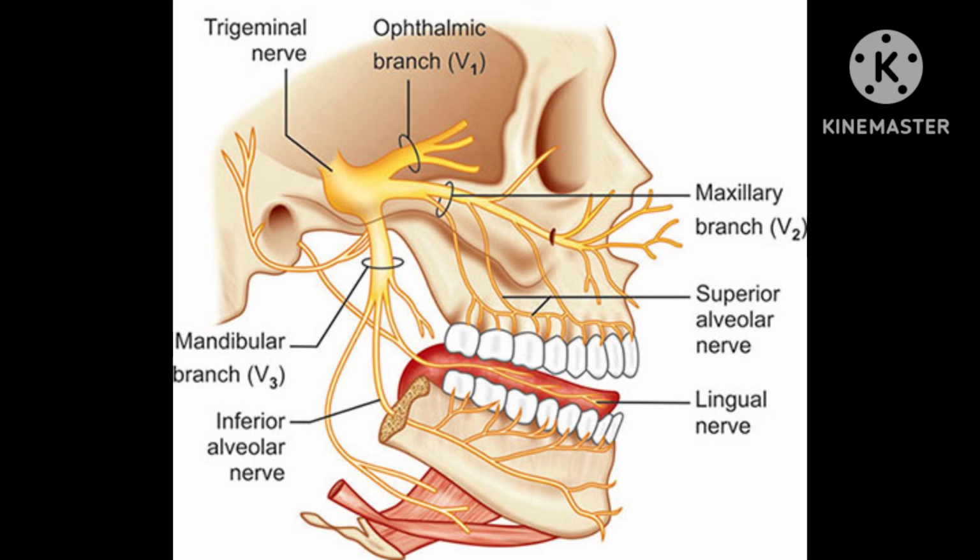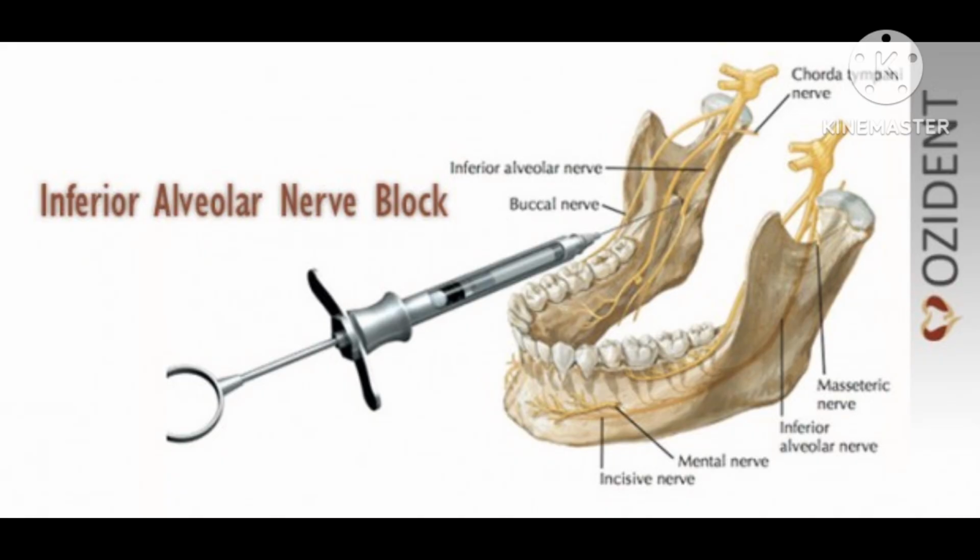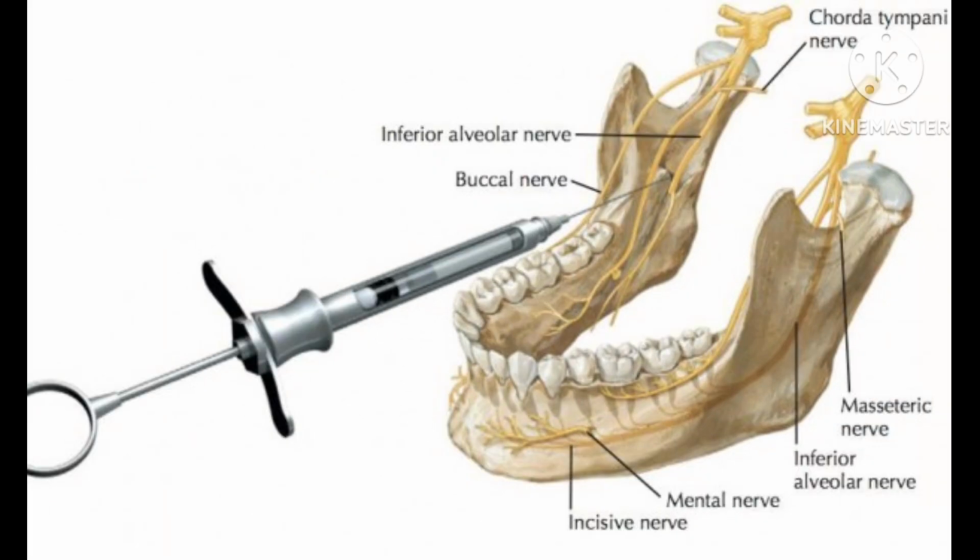Anesthesia of molars and premolars, block. Nervus alveolaris inferior, N. alv-inf. This nerve, which innervates the mandibular molars, is blocked using a mandibular injection. The injection is administered just before the nerve enters the foramen mandibuli. This technique anesthetizes several teeth on that side.